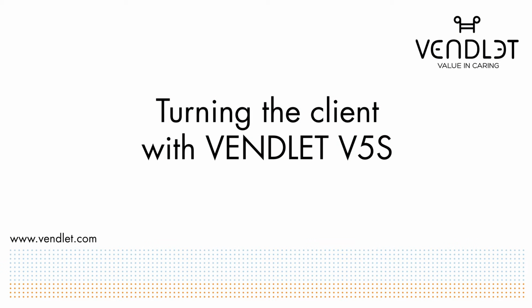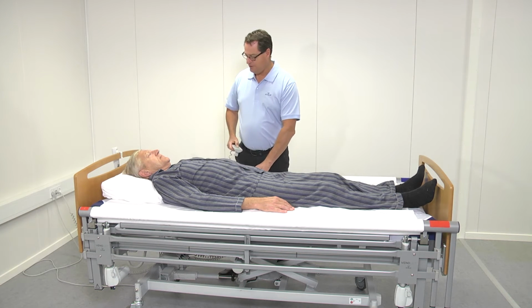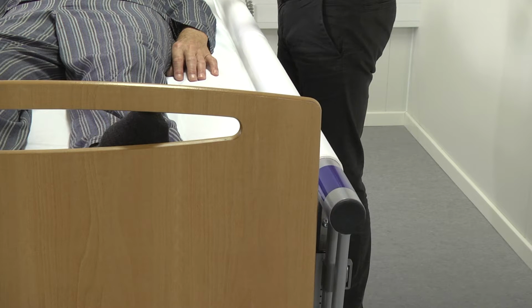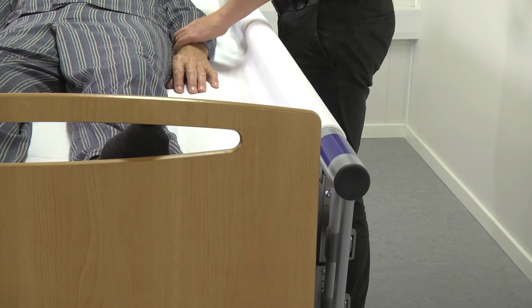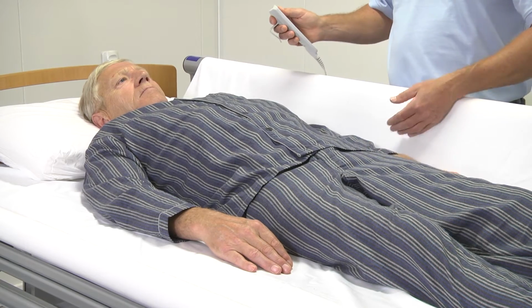We will now show how to turn a client onto his right side. First, raise the bed to the appropriate working height. Then, raise the blue bar. Wind the sheet up onto the blue bar and guide the client's left arm over the chest.